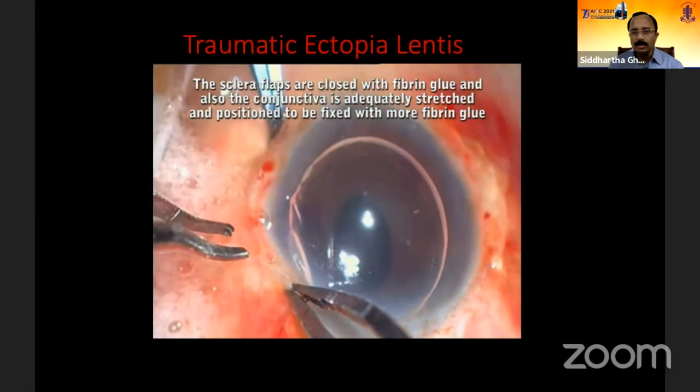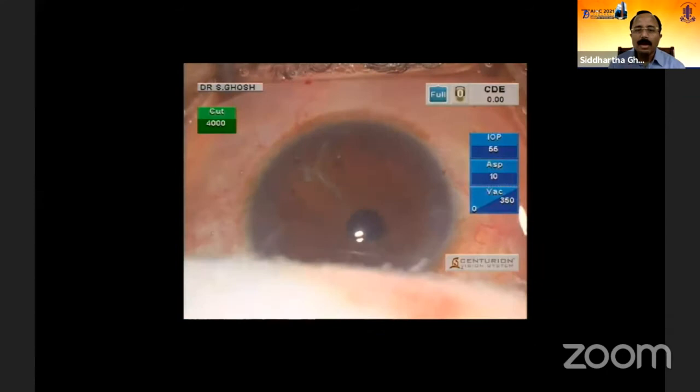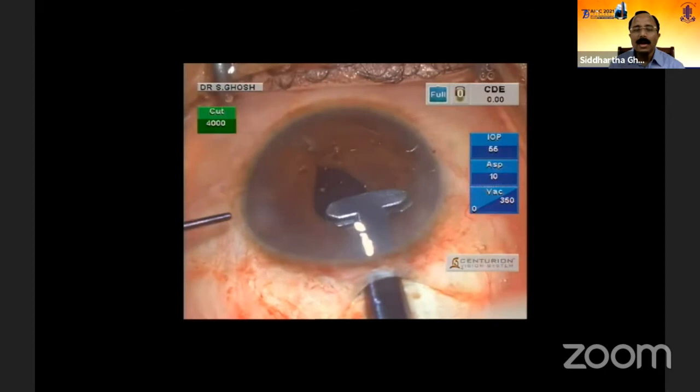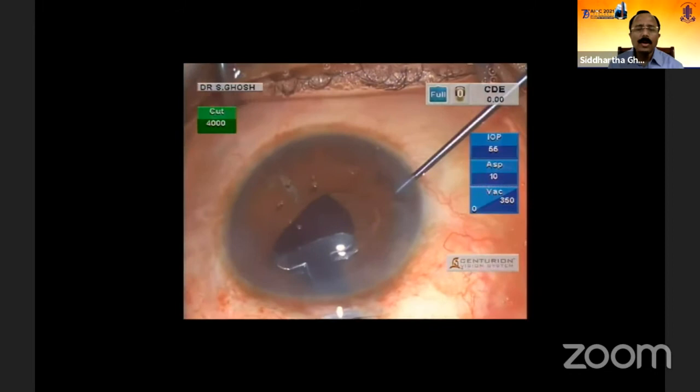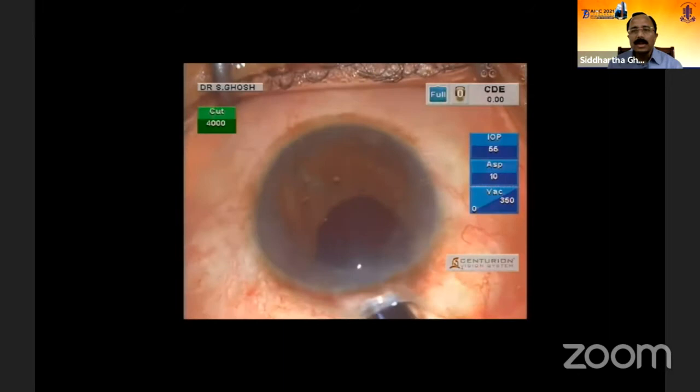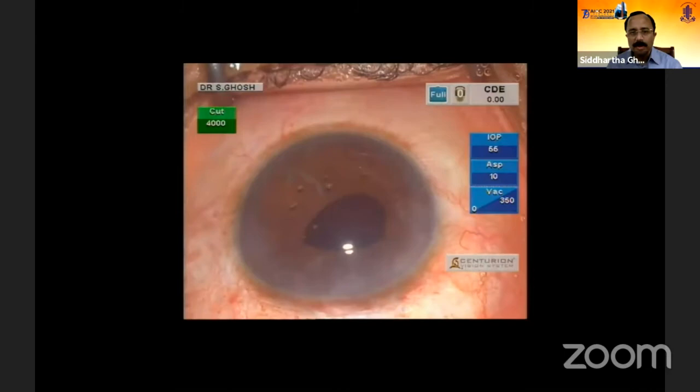This is just the other kind of lens that I generally prefer in this case. This is fast and simple. Dr. Chitra Ramamurthy has also shown it's an iris clip lens, and it's easy to tuck it behind the iris. It's very simple, less time consuming, and later on long-term results are pretty good because you can dilate and see the fundus. The only issue is the pupil size may initially not be so round, but gradually with time it becomes round, and there are no long-term problems as of now.